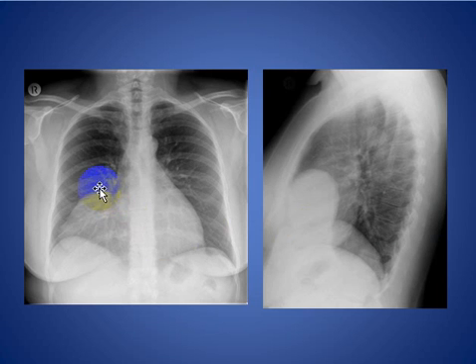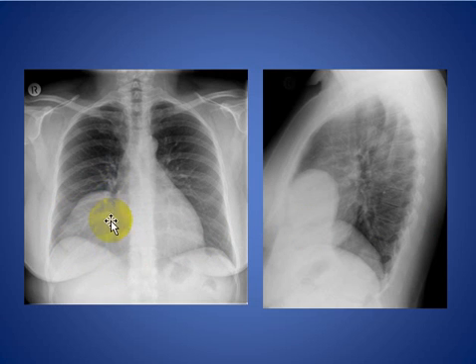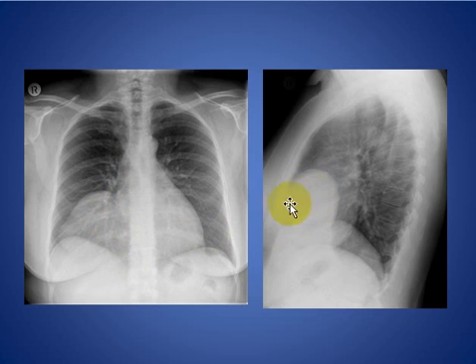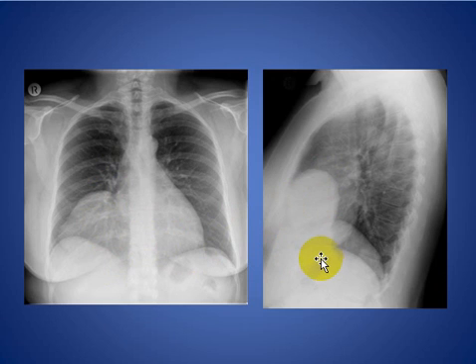Here we see a large mass at the right cardiac border, silhouetting with the right cardiac border, indicating it is anteriorly located. The differential diagnosis of a right cardiophrenic mass includes Morgagni hernia.